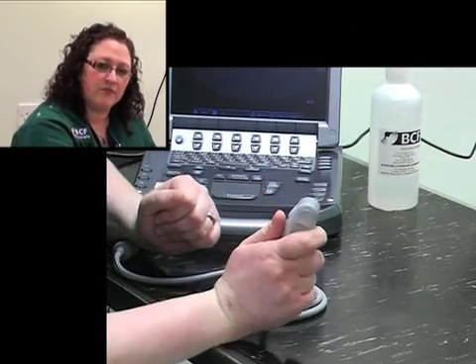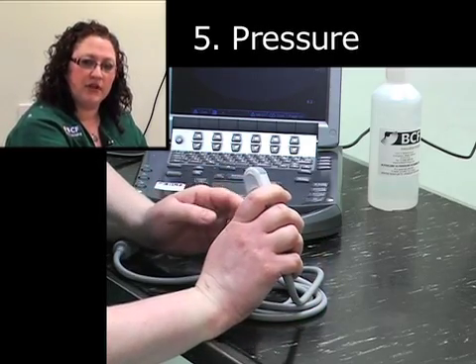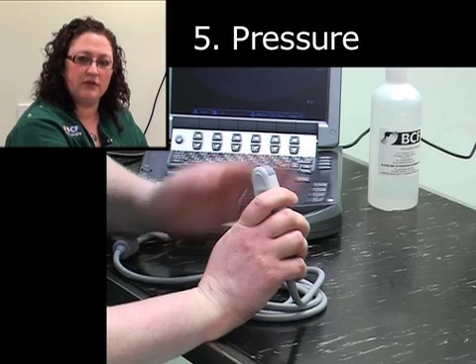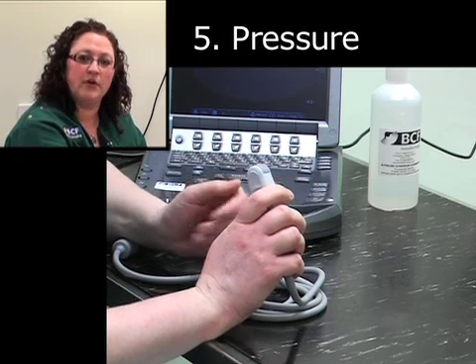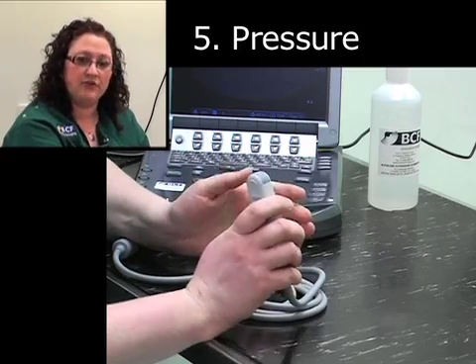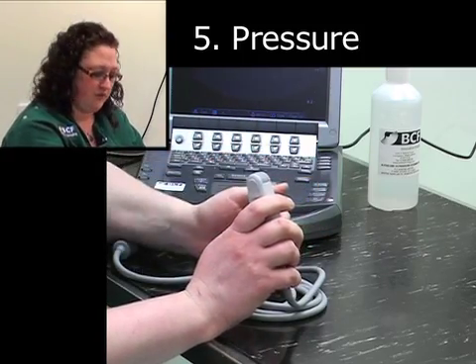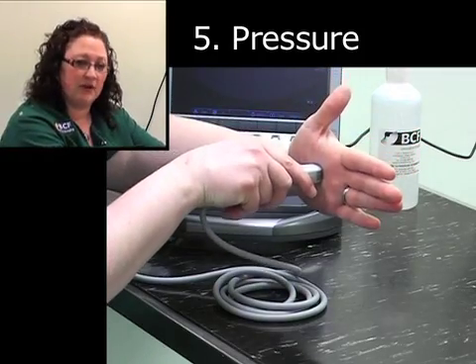And the last movement that you can do is pressure. It's very important to realize that this is a movement because it will make a tremendous difference to the quality of your image as you go throughout your abdominal ultrasound examination. Pressure is either increased amount of pressure or decreased amount of pressure.